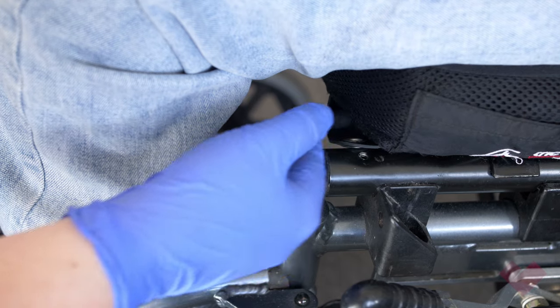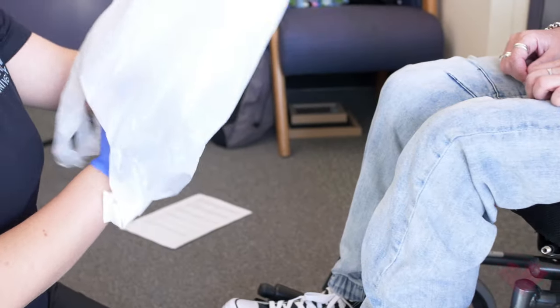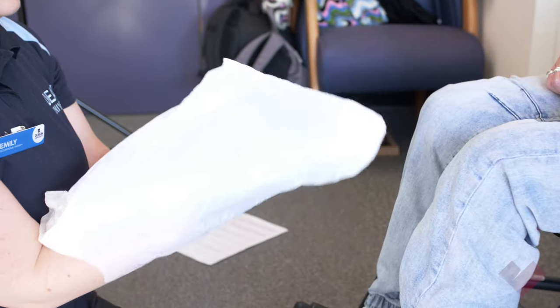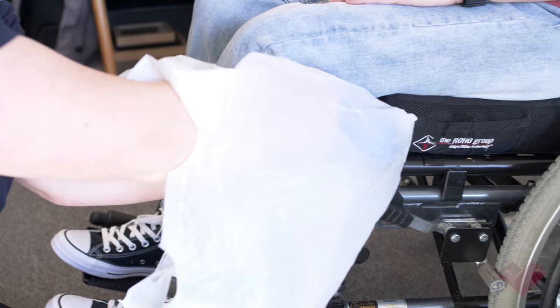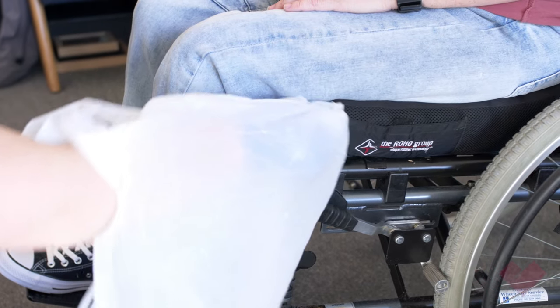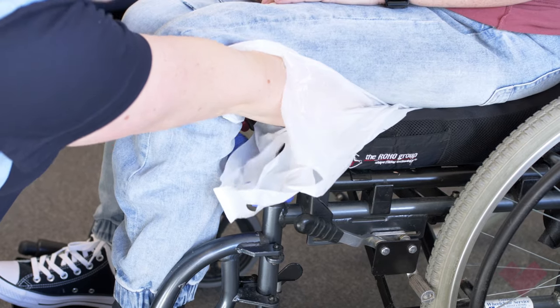Slightly loosen the air valve, but not enough to let any air out. Then place the plastic bag over your glove. In line with the person's knee, slide your hand up under their bottom palm down, feeling for their most bony prominence — the ischial tuberosity.